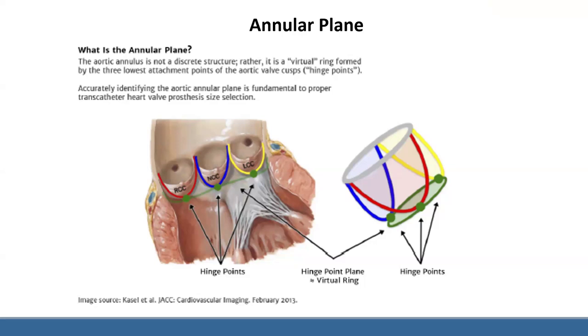On a lighter note, I'll share with you what David Ildick Smith once told us. The initial TAVRs that they were doing, they didn't have this concept of CT scan. They had only three slices of the valve, and they made the measurement with an echo and a pigtail injection. That's it. There was no question of recapturing and redeploying. You had one chance to deploy the valve, one chance to make the measurement, and that's it.